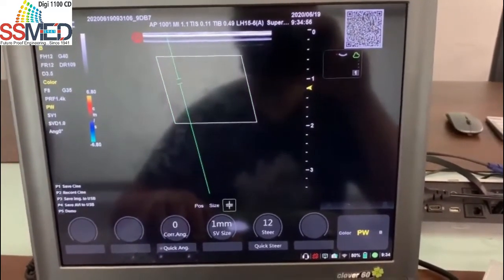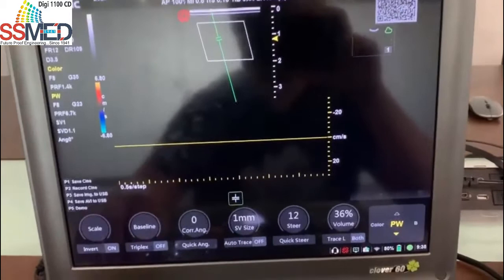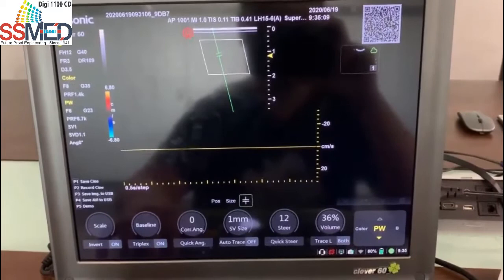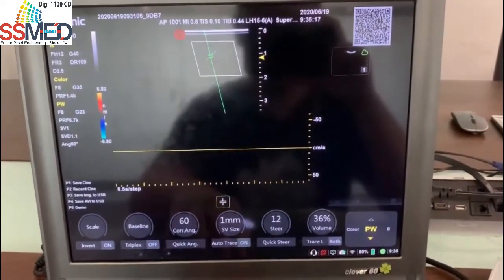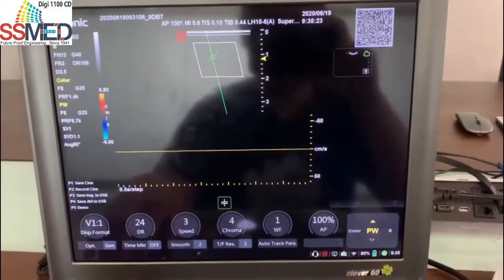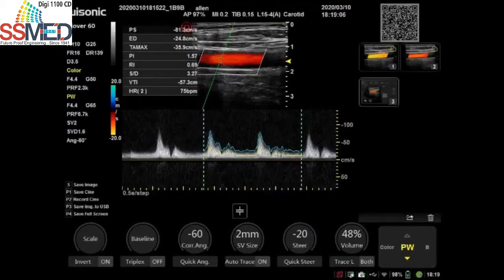And here comes the PW mode. We can push the update button to start PW mode, and as you can see, we have the auto trace, triplex and the quick angle change, this kind of things. Quick steer angle. So here is the picture for the auto trace. It will look like this one.